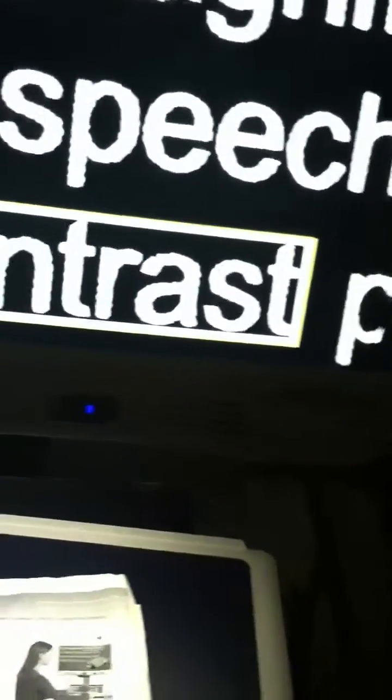But, you do the scan button. And we have to focus it onto something. Okay, let's try that. I'm going to press the scan button on the remote. No text found. Told you I'm not good at this. Okay, let's try this again. Speech. Contrast. Done. Alright. Anyway, I'm really bad at it, but it reads. You get the point. Another thing is you'll see the color box here, so you can see as it's going. It has a little cursor so you can read along. So that's pretty cool. So anyway, that's the main gist of it.